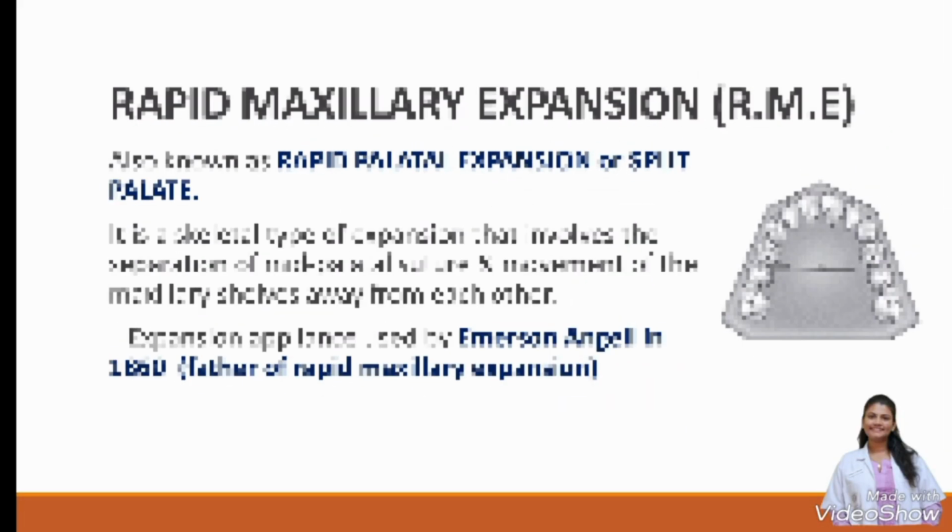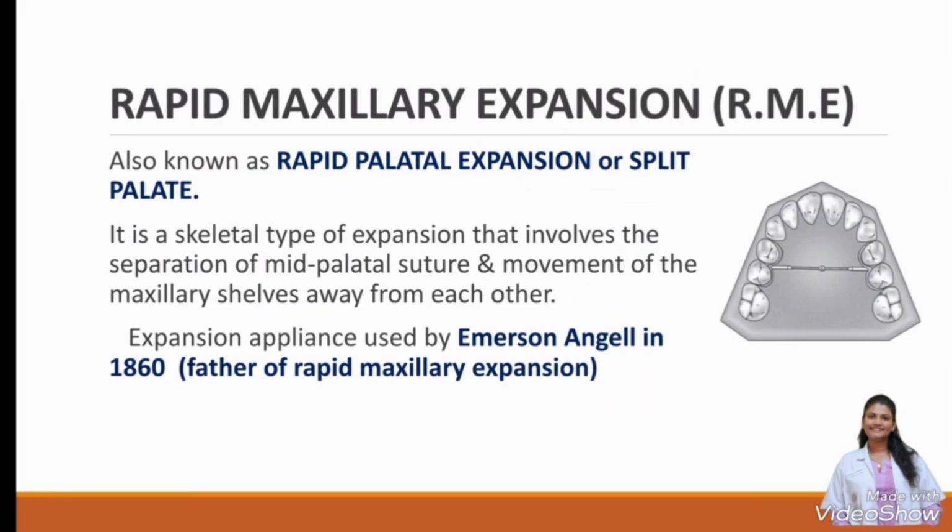Here I'll be continuing with rapid maxillary expansion, which is also said to be RME, also known as rapid palatal expansion or split palate. It is a skeletal type of expansion that involves separation of mid-palatal suture and movement of maxillary shelves away from each other.